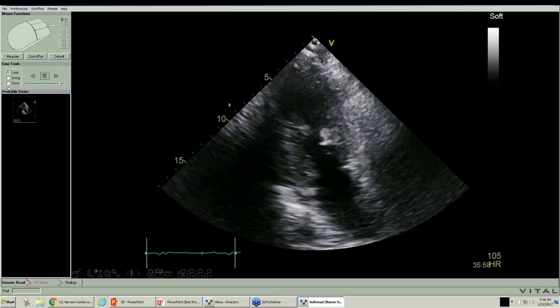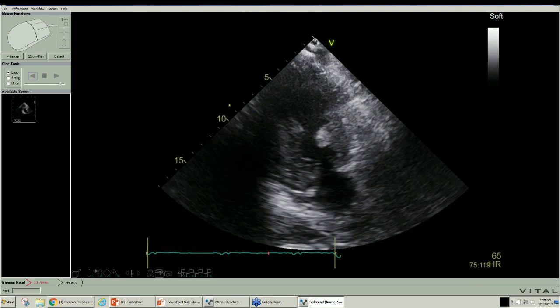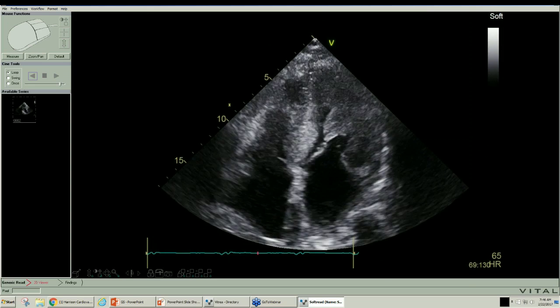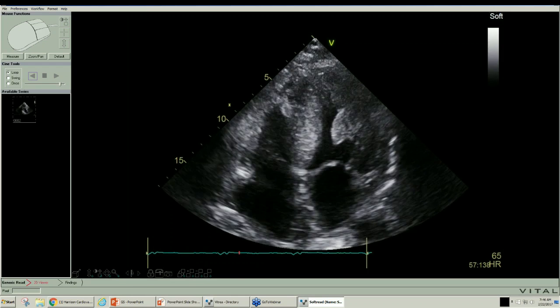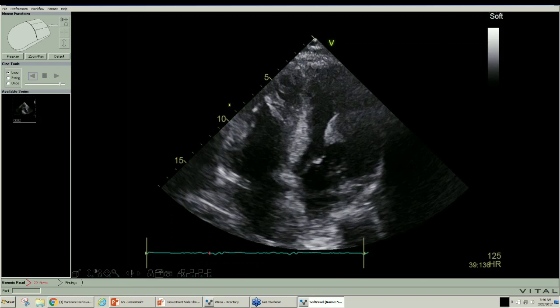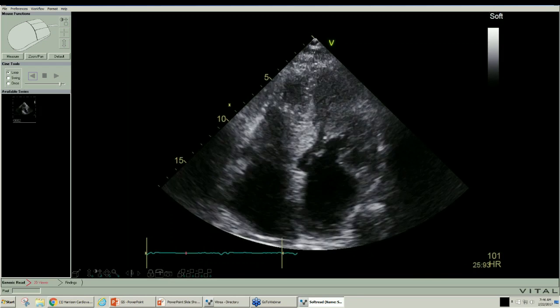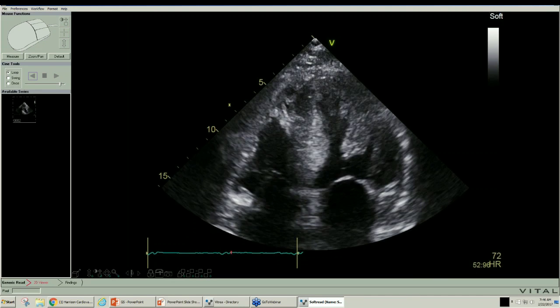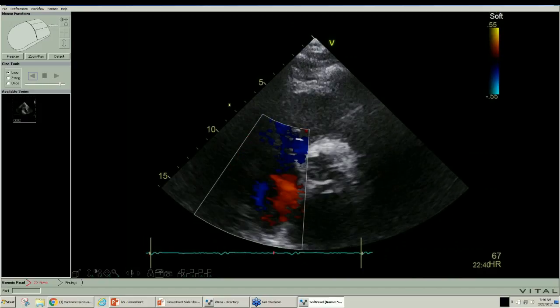So imaging is the ball game for evaluating patients with amyloid heart disease. Actually, the papillary muscles look funny there. See, look, that's looking funny. The septum, actually, now that you see it, you start thinking, well, things don't look right. It doesn't look like it's homogeneous myocardium. The septum looks much stronger in terms of echoes and speckles, and this papillary muscle has a much stronger, brighter look to it, not unlike what you saw when we did the late gadolinium enhancement. So I think there are other hints that we can see here.